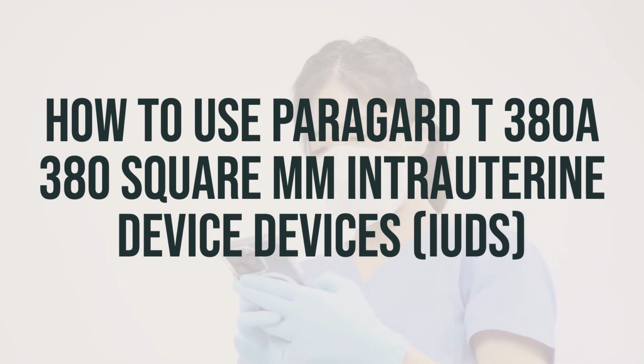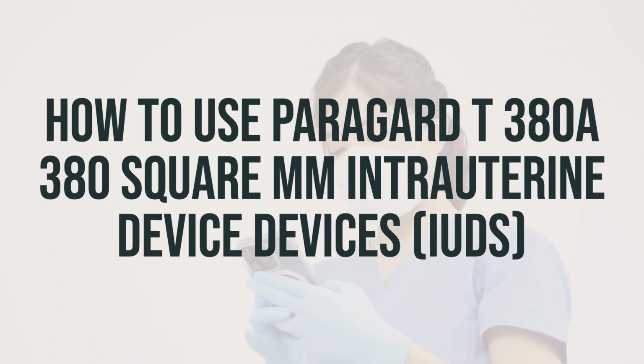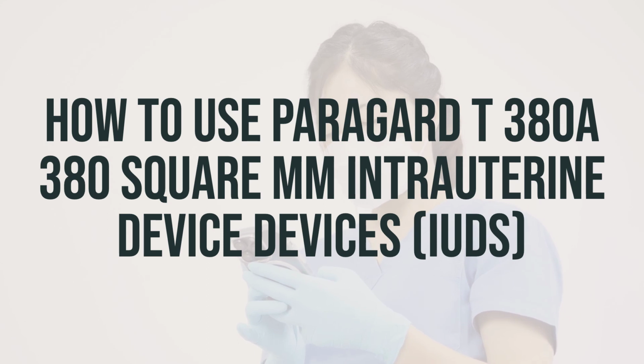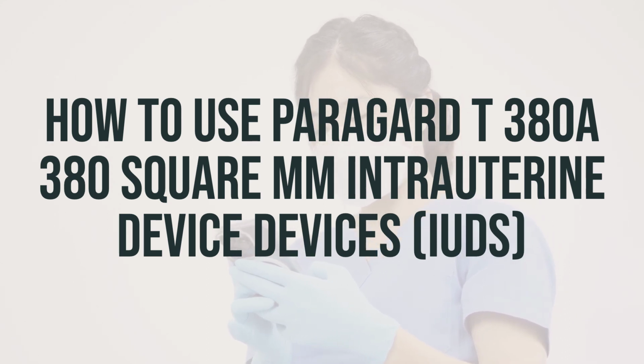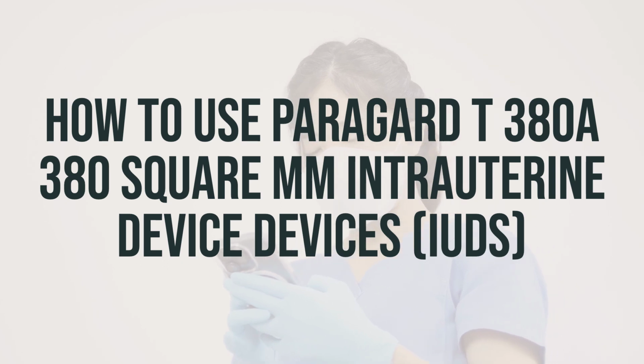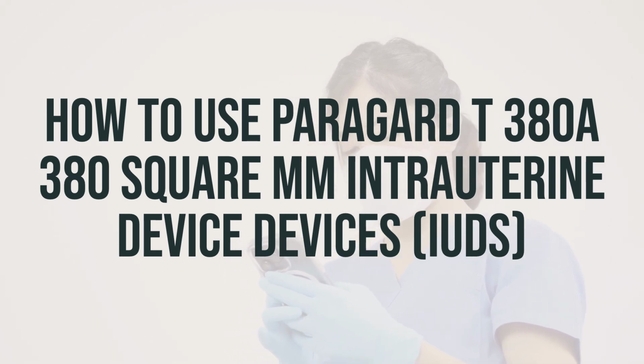If it comes out or you can't feel the threads, contact your doctor and use backup birth control. If you want to continue using this method after 10 years, the device should be removed and replaced with a new one. Your healthcare provider can remove the device whenever you decide to stop using it.